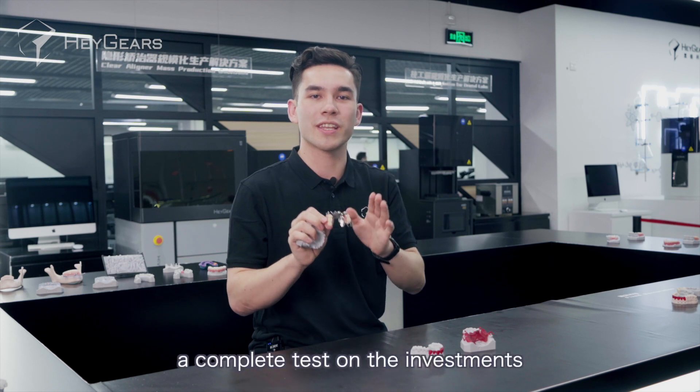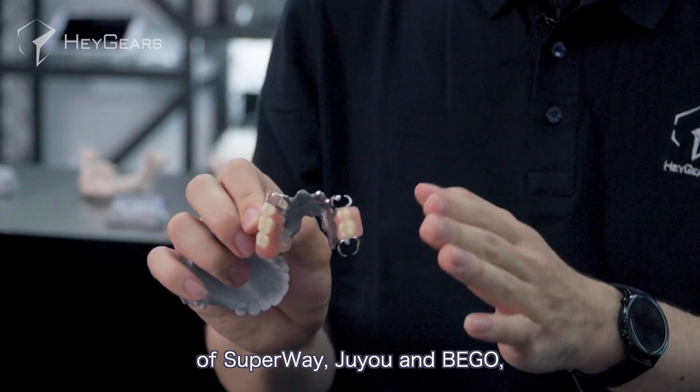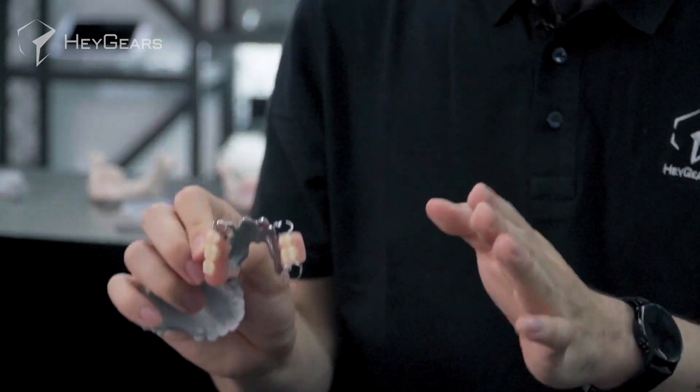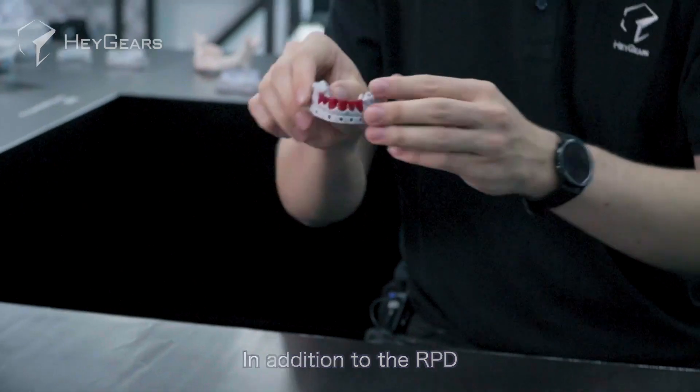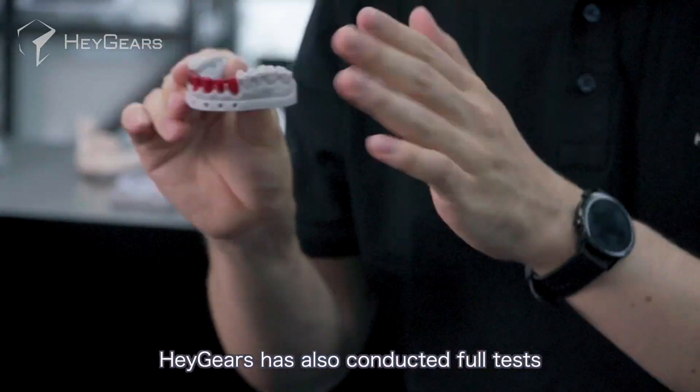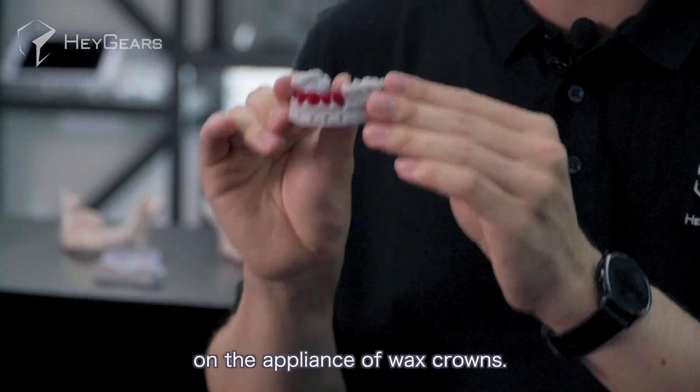At present, Heygear's has conducted a complete test on the investments of Superway, Juyou, and Bego, and the customers are very satisfied. In addition to the RPD, Heygear's has also conducted full tests on the appliances of wax crowns.